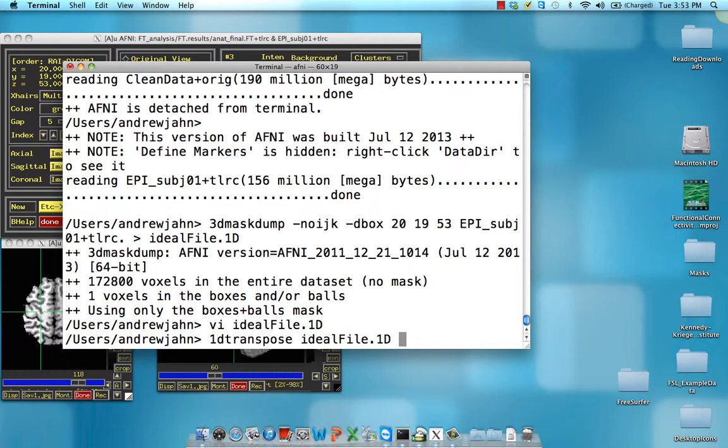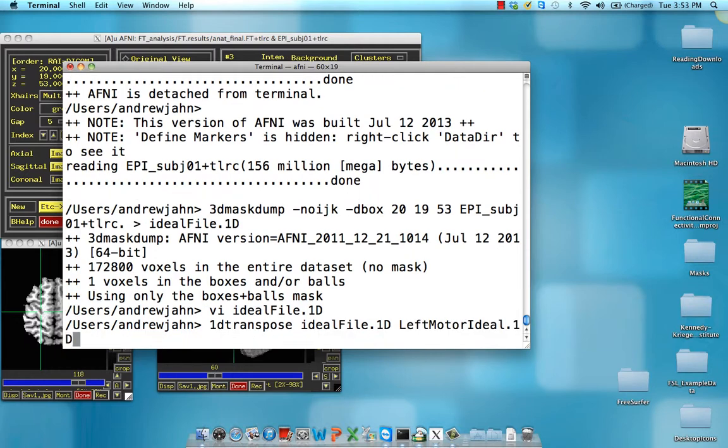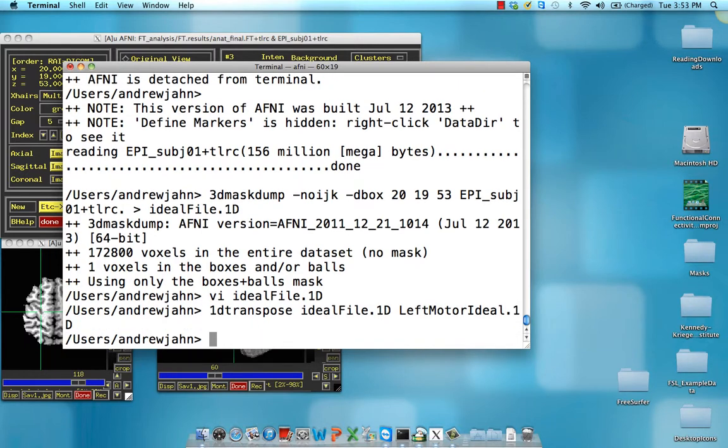So idealfile, we're going to call this leftMotorIdeal.1d. So it just replaces this, or doesn't replace the file, but just transposes it and puts it into leftMotorIdeal.1d.